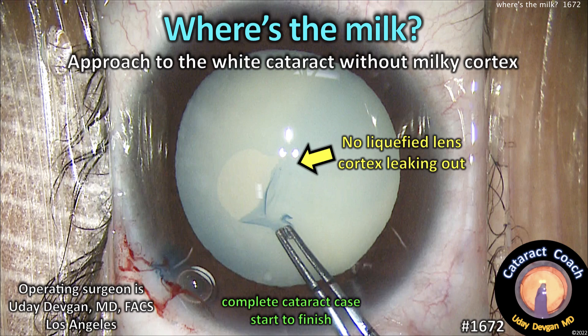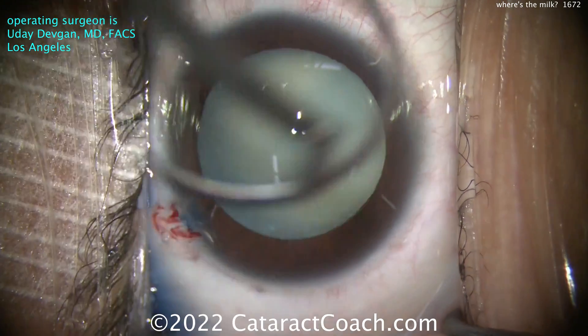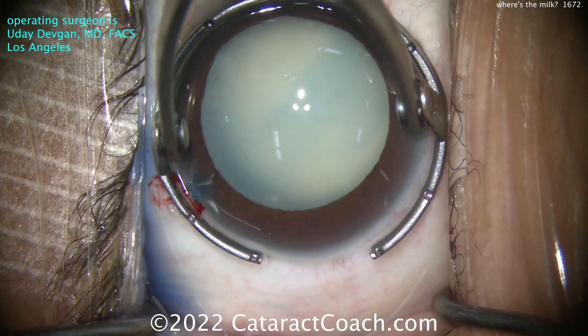cataractcoach.com - the 'where's the milk' approach to the white cataract without milky cortex. Notice no liquefied cortex is leaking out. Let me show you the whole surgery start to finish. Trypan blue dye, eye full of viscoelastic.